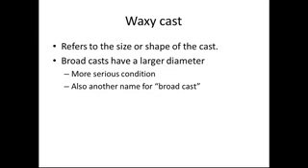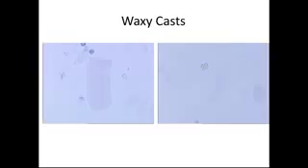And waxy casts refer to the size and the shape of the cast. They are very broad and have a large diameter. More serious condition, and the other name for it is a broad cast.